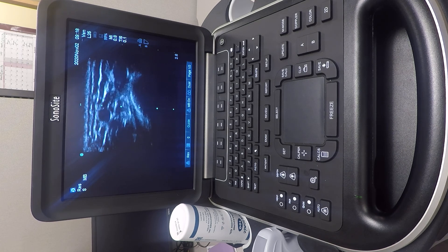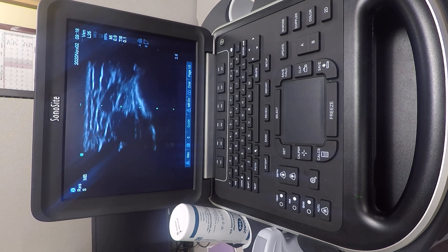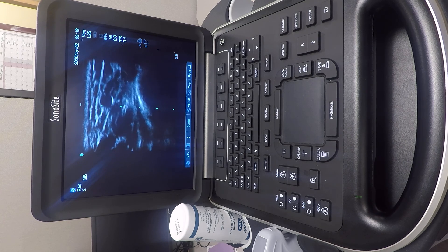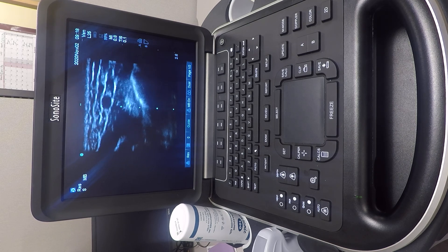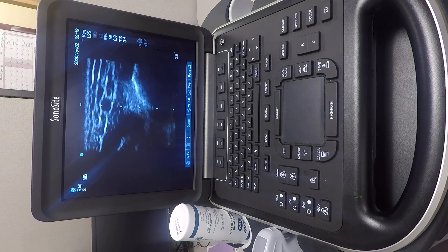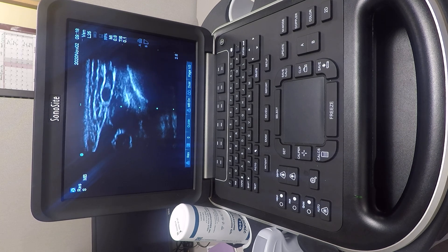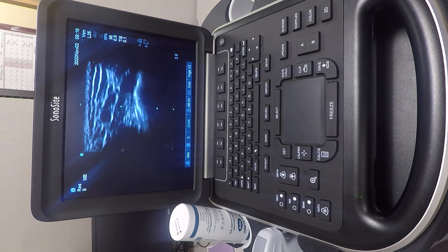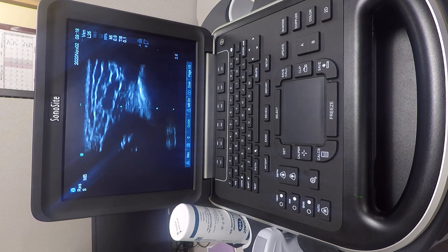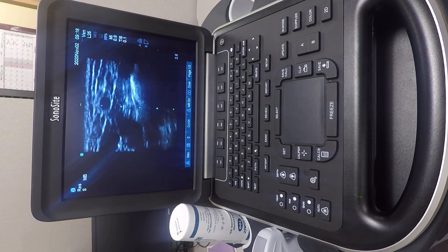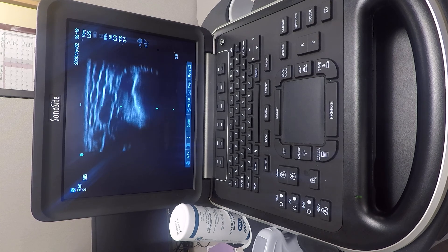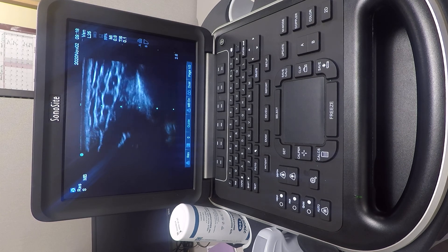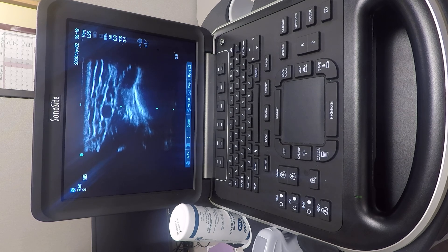That compressible circle would be a vein. Our radial artery has two veins, one on either side — Mickey Mouse, if you will. You can see one compresses here, the other one there. That's how we identify arteries and veins using two different methodologies.